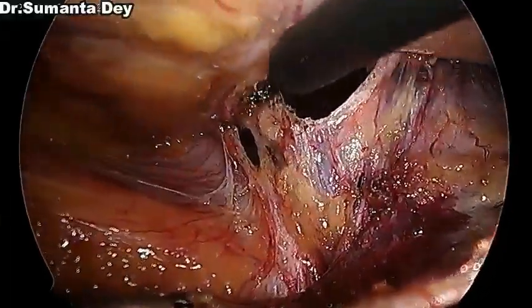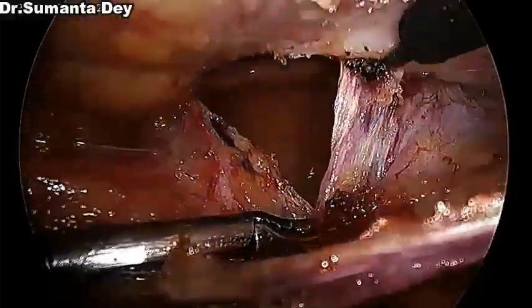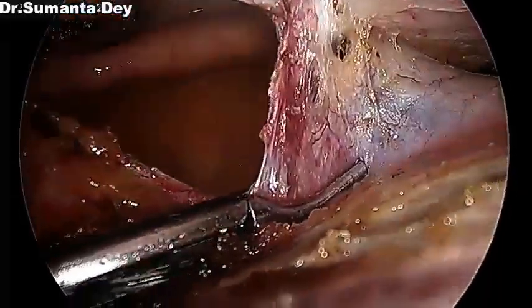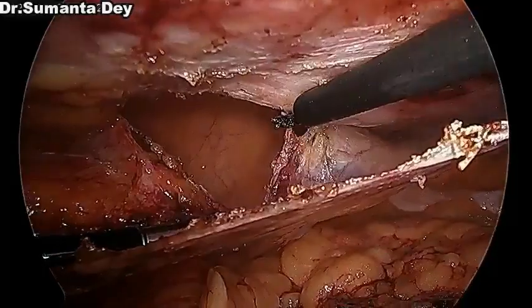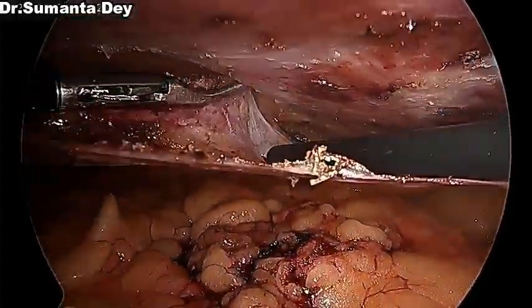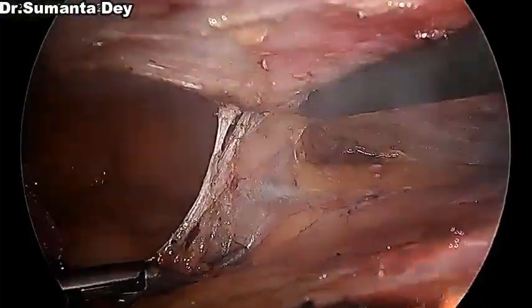So now I'm making the incision, because beyond that I won't be able to reach. So I'm dividing the peritoneum around the hernial defect, and under vision, I'm pulling the margin of the peritoneum and giving a good amount of traction downwards. And following the hernial defect border, I am encircling the peritoneal rent following the hernial margin.